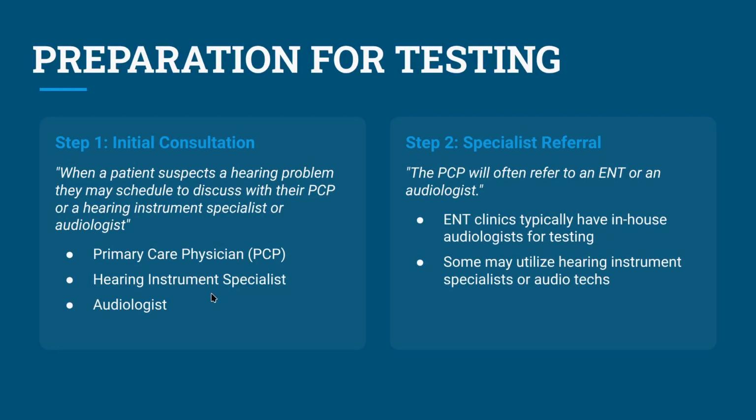So for preparation for testing, we start with the initial consultation phase. When a patient suspects a hearing problem, they may want to schedule or discuss with their primary care provider or a hearing instrument specialist or audiologist. That's their initial entry point into the hearing healthcare system, either their PCP or their hearing healthcare provider, most commonly a hearing instrument specialist or audiologist.